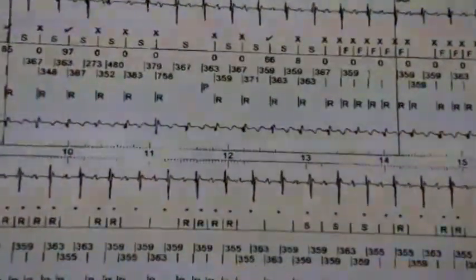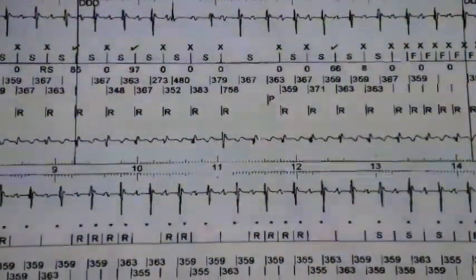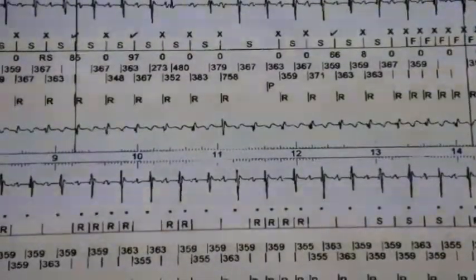this R wave. So if we hide the T wave, we will probably hide an R wave. And we already see, we're already not sensing some R waves, okay? This is an R wave that's not being sensed, really because of this signal here. Yeah, this signal made this not be sensed, okay? It's normal. We can see this sometimes, okay?